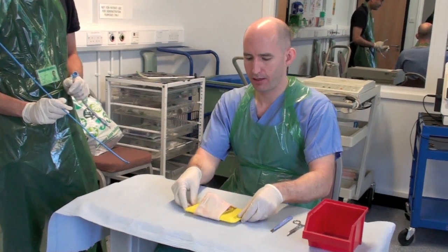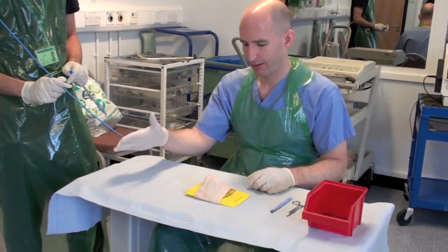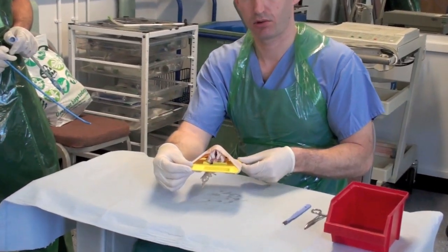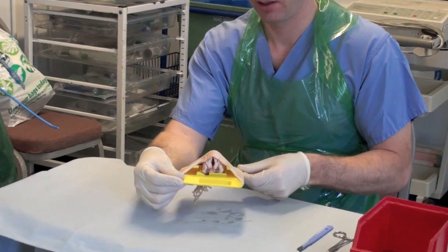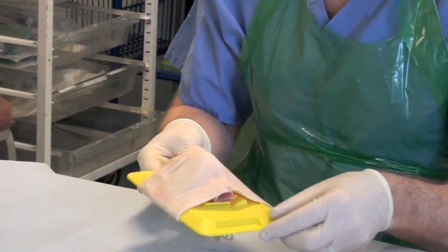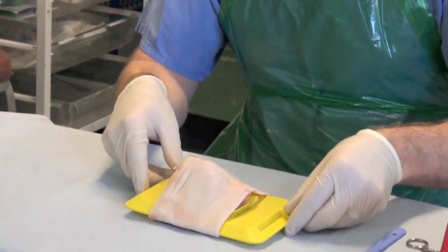Essentially here is your specimen — the head end would be here. I've got a little trachea; you can actually see the cords at this end, and at the bottom there is a short section of trachea there as well, covered by a shammy.